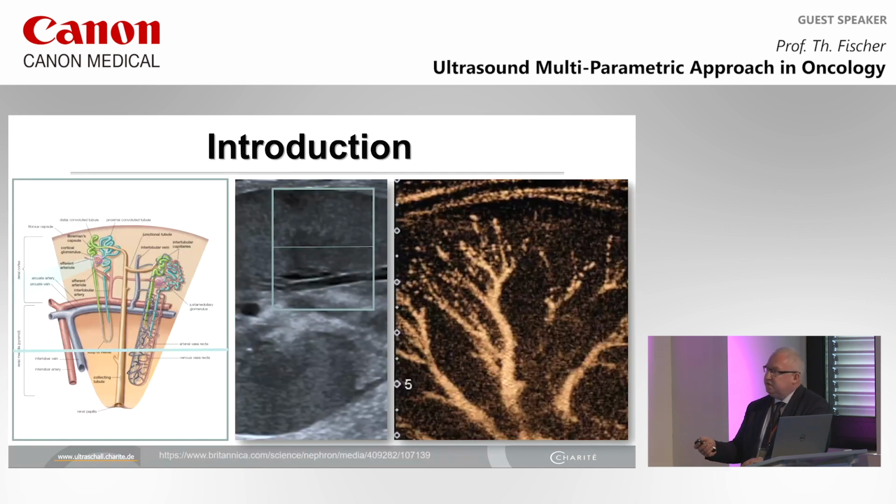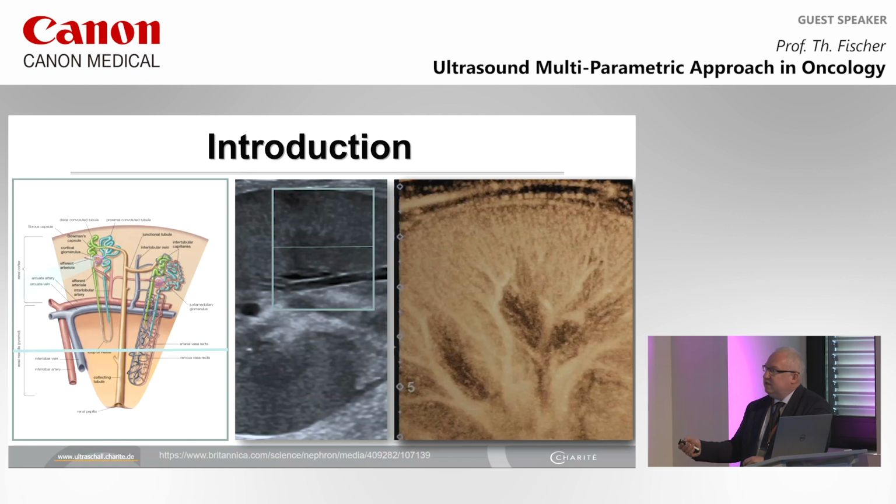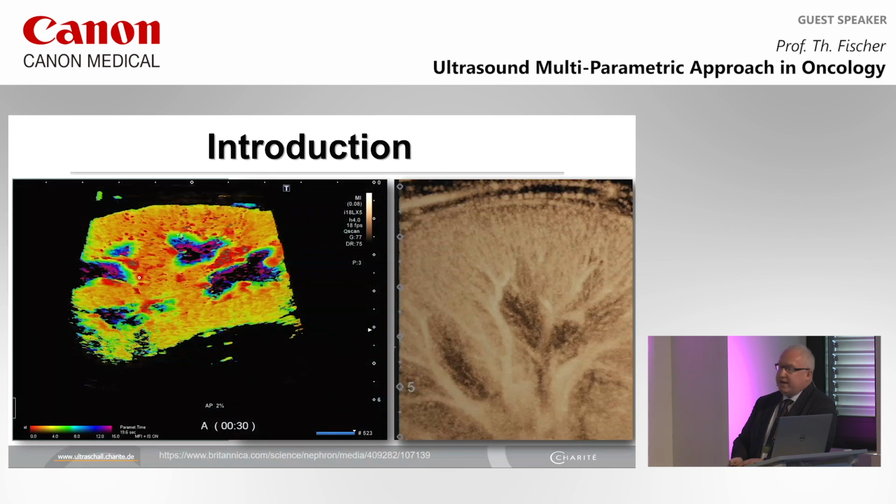Coming back to this fill-in pattern: interlobar artery, arcuate artery, cortical arteries. Next step is inflow in the renal cortex. No medullary contrast enhancement. And you can see here the anatomical details. So that means we have a tool which corresponds very well with the anatomical overview. And that's very important to know. And then a fill-in of the pyramids, starting from the outer contour to the central portion of the pyramids, with a much lower flow in contrast to the renal cortex. That's regular anatomy. That's beautifully reconstructed.